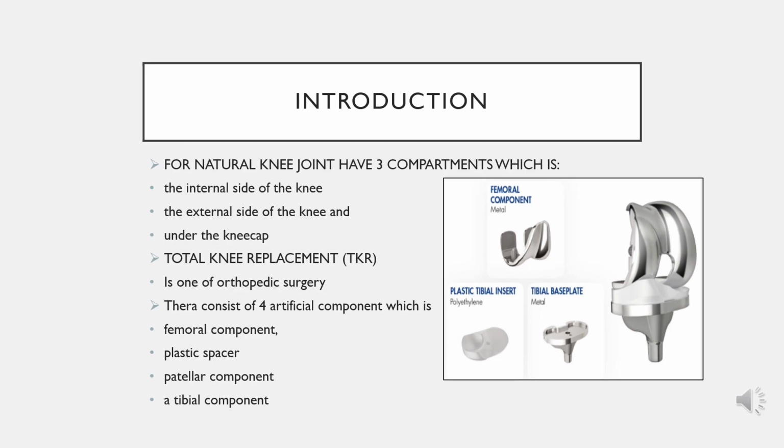One of the common surgical procedures for the knee is total knee replacement, which involves replacing the articular surfaces such as the femoral condyles, tibial plateau, and polyethylene plastic. Total knee replacement is one of the orthopedic surgeries. During TKR, each compartment of the knee is replaced.